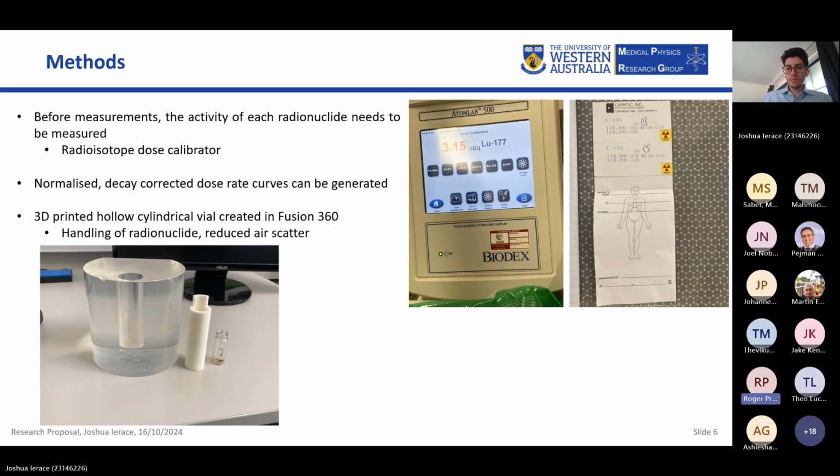The second one is that a very interesting question was raised about tolerance. Tolerance is difficult, what kind of error do you tolerate? That really depends on whether it will change the directive given to the patient or how the medical physicist changes their work practice. If the work practice or the directives are not changed, then it's within tolerance. In other words, you're really interested to know what sort of variations would actually affect a change in the behavior or direction of the patient.